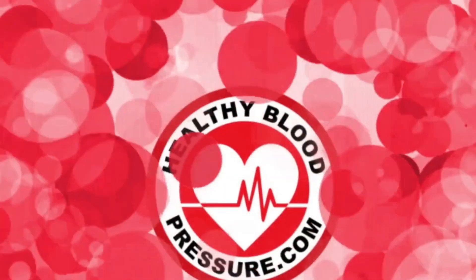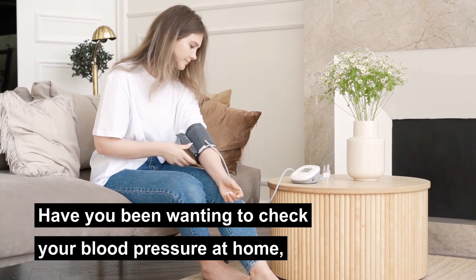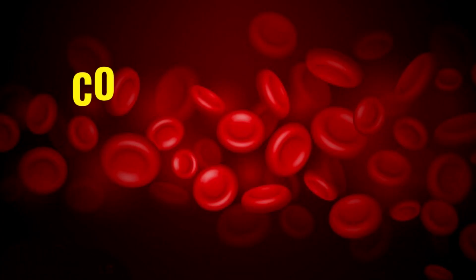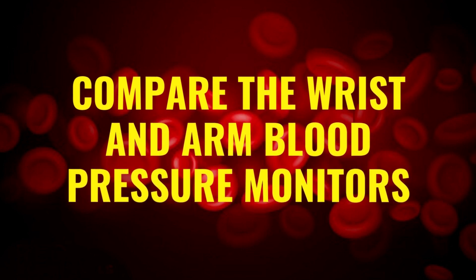Hello, all you healthy blood pressure warriors. My name is Ingrid and I want to welcome you to the HealthyBloodPressure.com channel. Have you been wanting to check your blood pressure at home but you're not sure which type of monitor to buy? In this video I'm going to compare the wrist and arm blood pressure monitors.